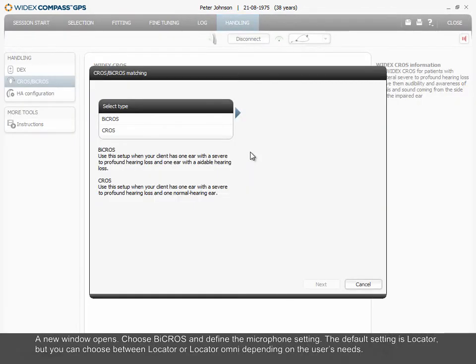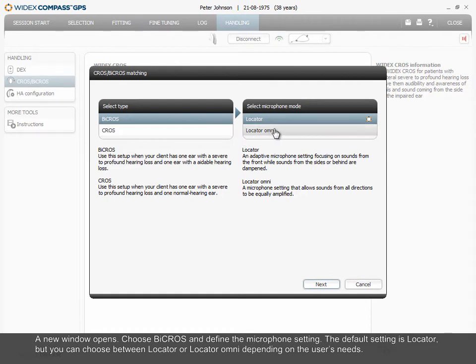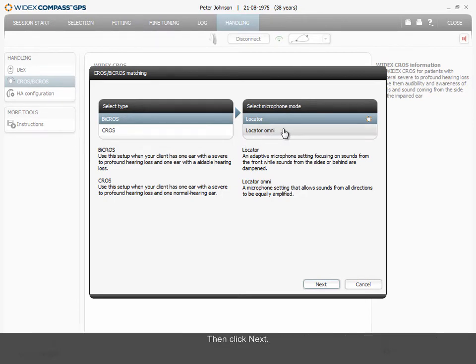A new window opens. Choose Bi-CROS and define the microphone setting. The default setting is Locator, but you can choose between Locator or Locator Omni depending on the user's needs. Then click Next.